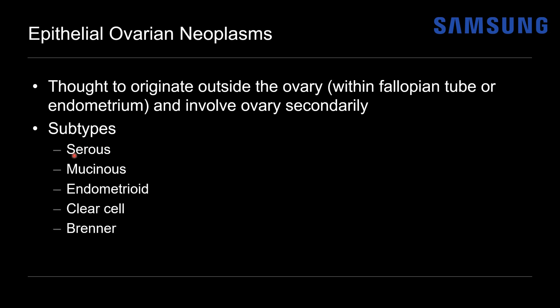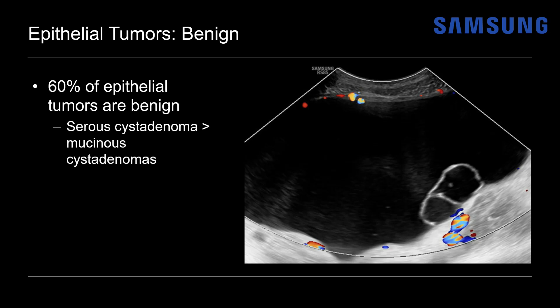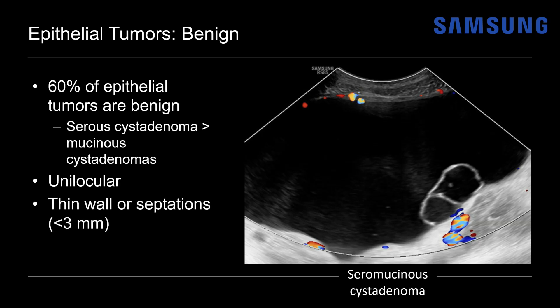Serous and mucinous tumors can be benign or malignant; endometrioid and clear cell are typically malignant; and Brenner tumors are benign. Most epithelial tumors — about 60% — will actually be benign, and those are usually serous cystadenomas with mucinous cystadenomas less common. Shown here is a combined seromucinous cystadenoma: a large tumor with low-level echoes corresponding to mucin content. Benign tumors tend to be unilocular; when septated, they have thin septations with a thin wall and no solid component.